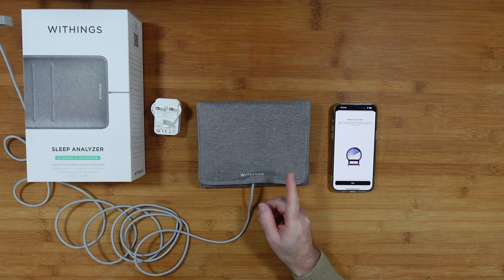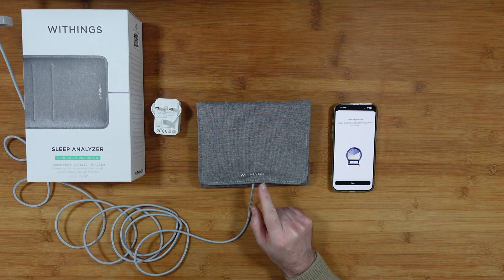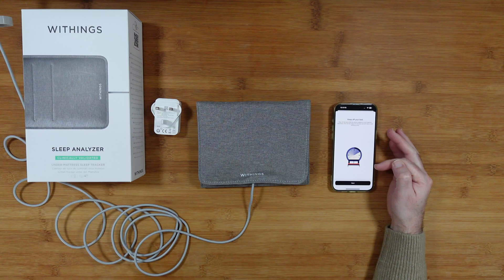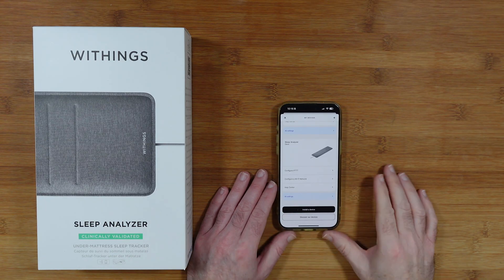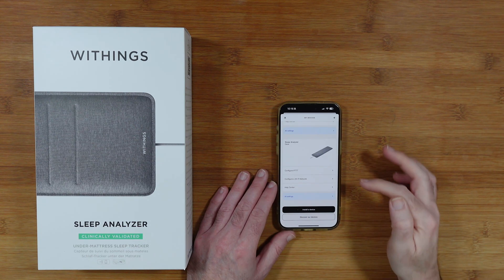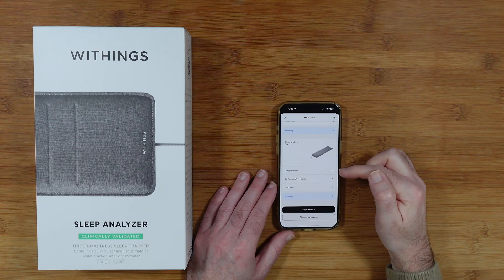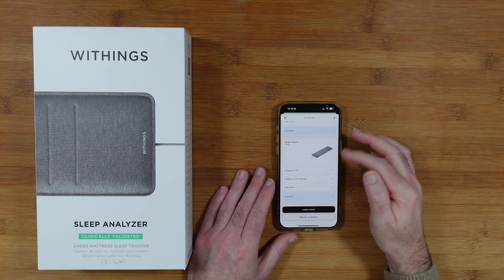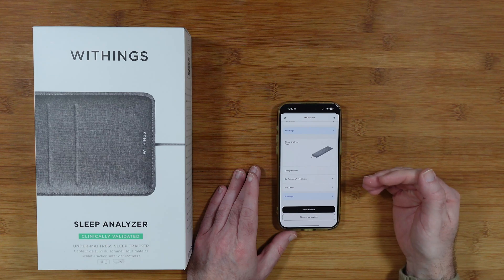I'm wondering whether I should have placed it under the mattress before starting, but it says 'Stay off your bed while the device adapts to your mattress.' So I've now popped it underneath my mattress and it's going through the configuration process. It has appeared inside my Withings app alongside all the other devices I'm using. It takes about 10 minutes for calibration, then it will be ready for my first sleep tonight.